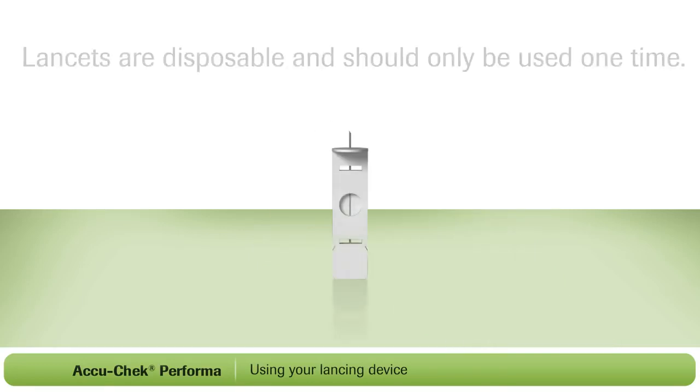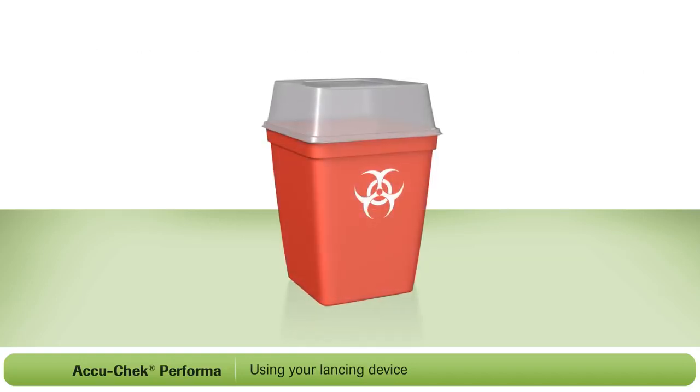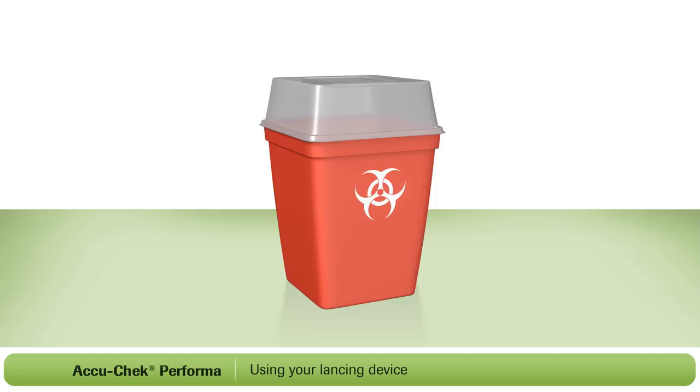This part is important. The Chek Soft Clicks lancets are disposable and should only be used one time. A reused lancet is no longer sterile, will lose its sharpness, and become more painful each time you lance your finger. When disposing of a lancet, always make sure that they cannot cause injury and always use a sharps container.